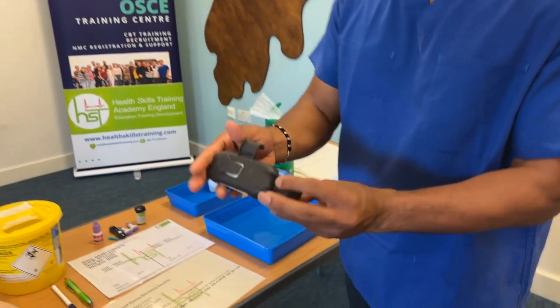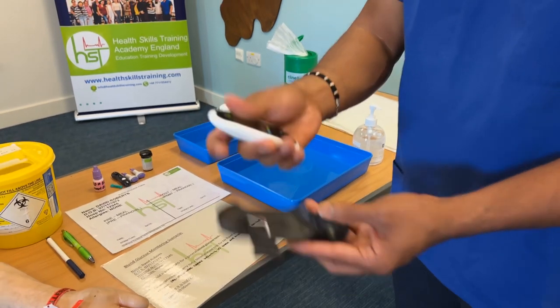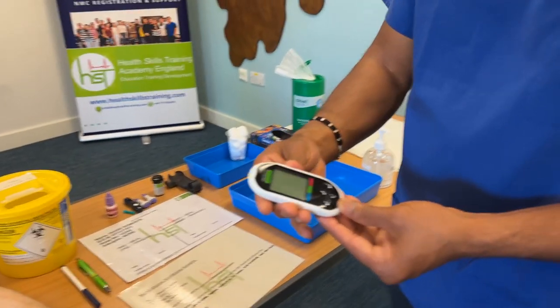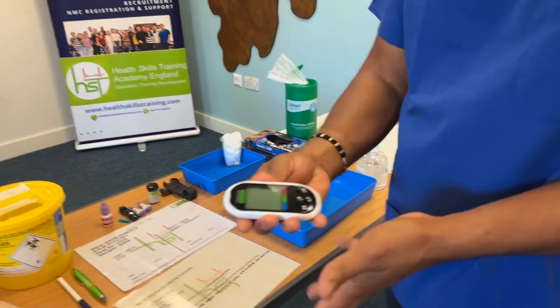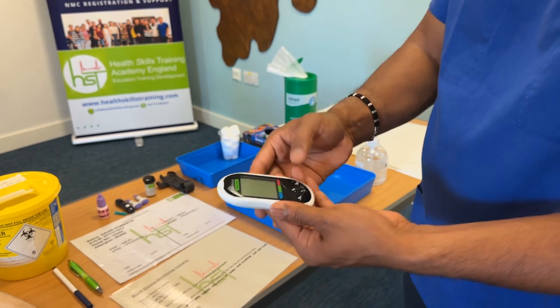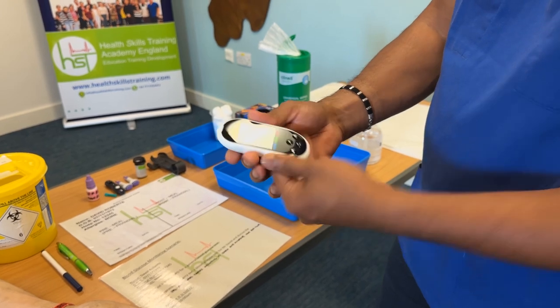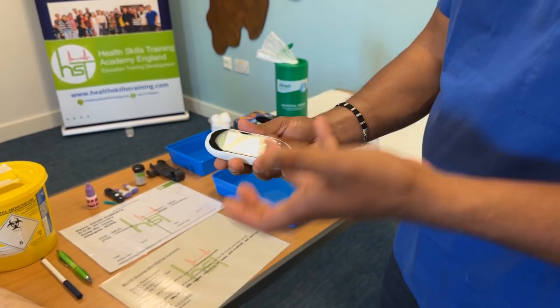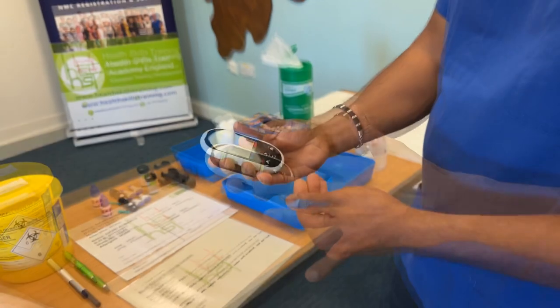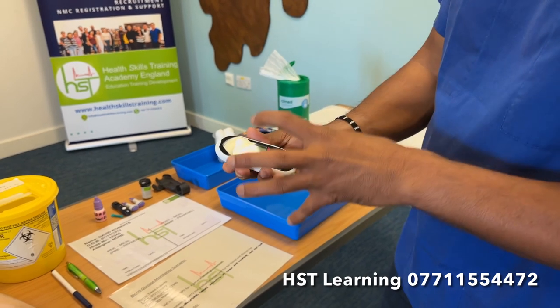Take the monitor out of the cradle. First thing you need to do is switch it on — a lot of people don't switch it on. There is a switch-on button; sometimes when you insert the strip it switches on by itself. When it switches on, check the date — is it the current date? Any error codes? Verbalize clearly to the examiner: 'This machine is in working order, today's date is visible, I am happy to use it.' Then ask: 'Examiner, is it clean and ready to use?'